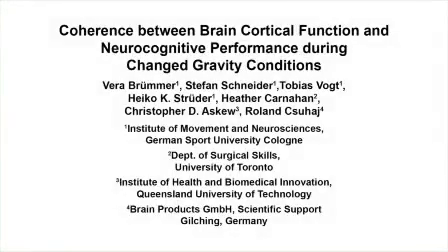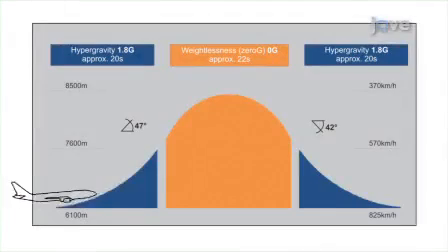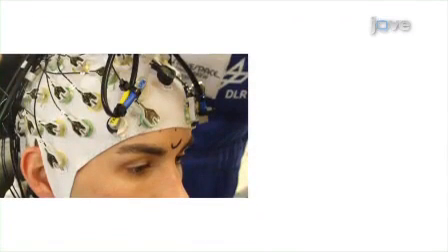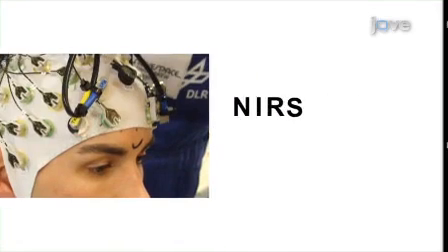This procedure applies a combined EEG and near-infrared spectroscopy recording technique to determine to what extent decreased neurocognitive performance in weightlessness is due to the primary effects of hemodynamic and electrocortical changes or to secondary stress-related effects. This is accomplished by monitoring changes in electrocortical activity of participants during a parabolic flight, including phases of microgravity, hypergravity, and normal gravity. Hemodynamic changes within the frontal brain can be monitored in parallel using near-infrared spectroscopy, or NIRS.